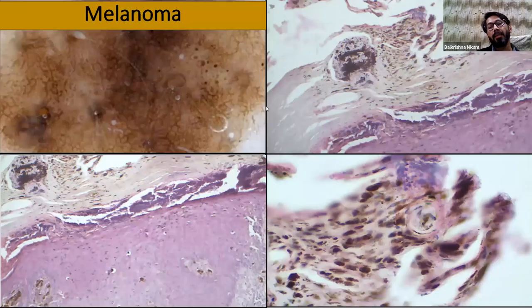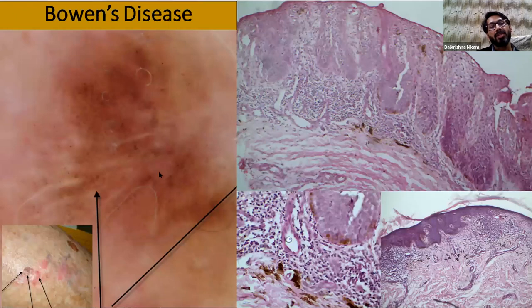Coming to melanoma, in the black dots, these are some of the black and gray dots, and they typically correlate with the melanin deposition in the stratum corneum, individual melanocyte ascent in the stratum corneum and the epidermis. Similar black dots, or gray dots, can also be seen in the deep dermis in Bowen's disease. And here also Bowen's is more or less demelanized, leading to a more erythematous lesion and visibility of these melanophages. If this is pigmented, these melanophages or these dots are not clearly seen.